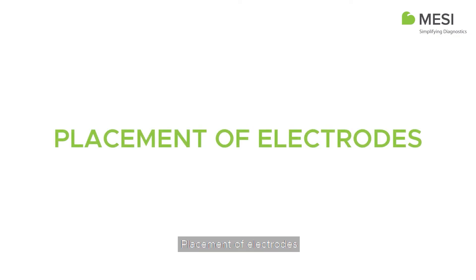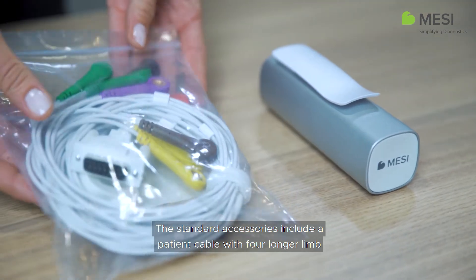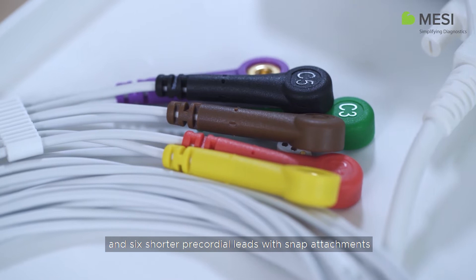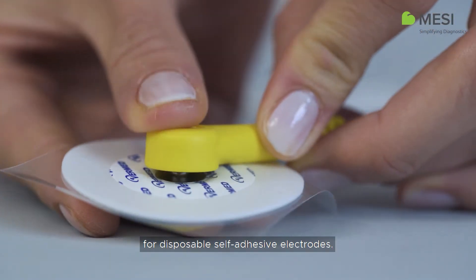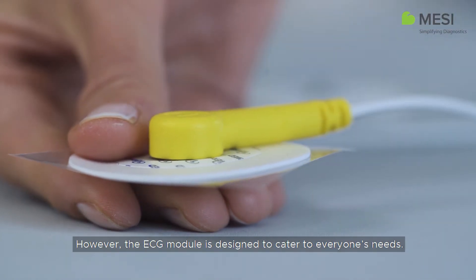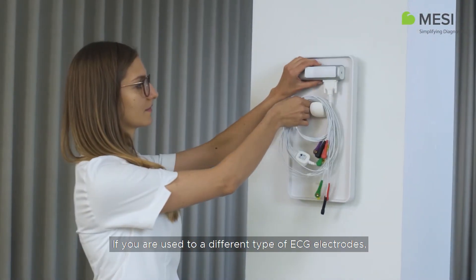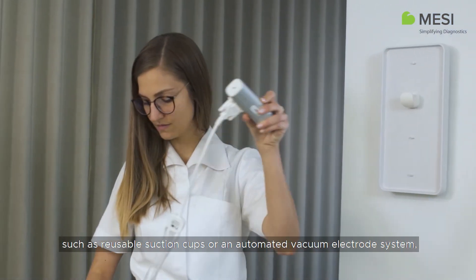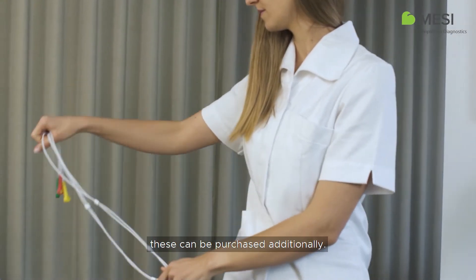Placement of Electrodes. The standard accessories include a patient cable with four longer limb and six shorter precordial leads with snap attachments for disposable self-adhesive electrodes. However, the ECG module is designed to cater to everyone's needs. If you're used to a different type of ECG electrode, such as reusable suction cups or an automated vacuum electrode system, these can be purchased additionally.